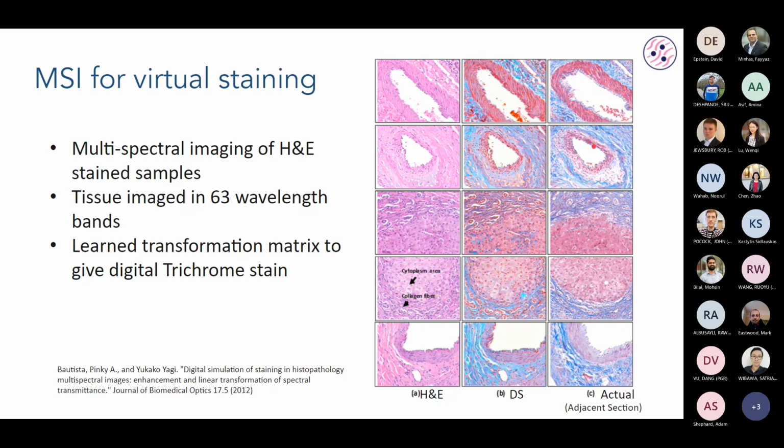I think the idea of that particular stain, I'm not massively knowledgeable on different stains, is to give more detail in the stroma between collagen and other things. But you'd have to ask a pathologist exactly what that stain is best used for and what it distinguishes.